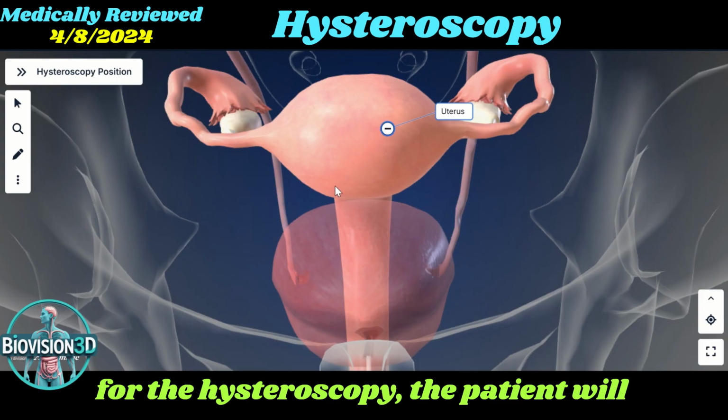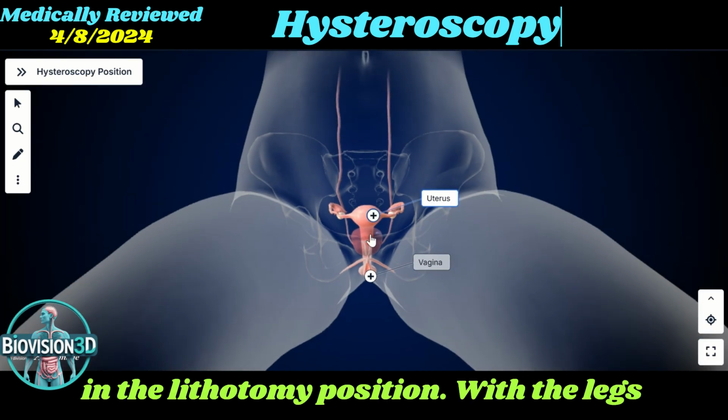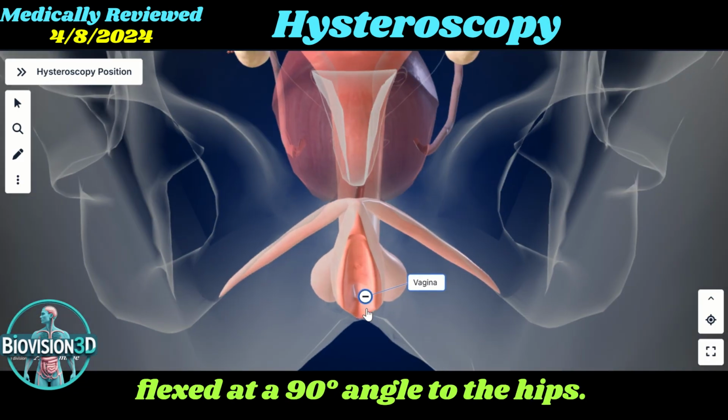In preparation for the hysteroscopy, the patient will receive local anesthesia and be placed in the lithotomy position, with the legs flexed at a 90 degree angle to the hips.